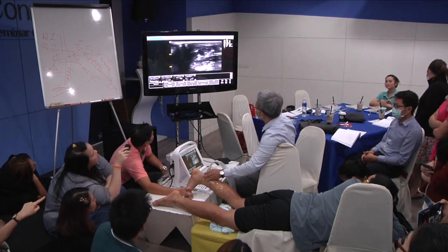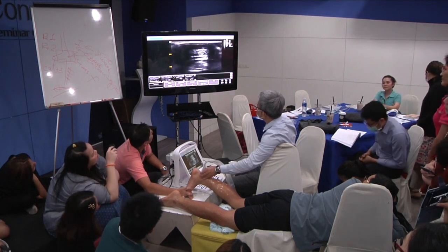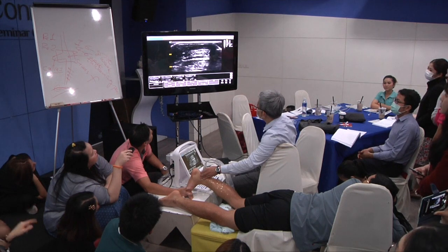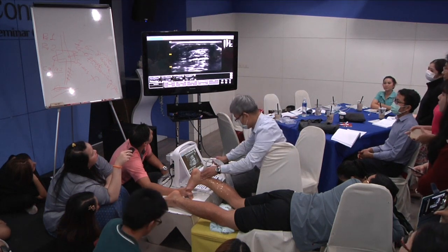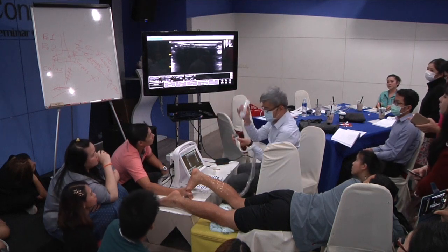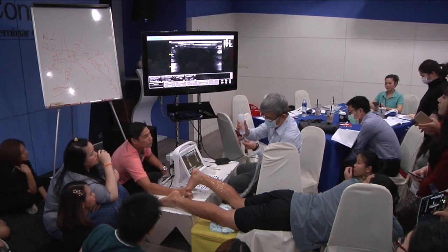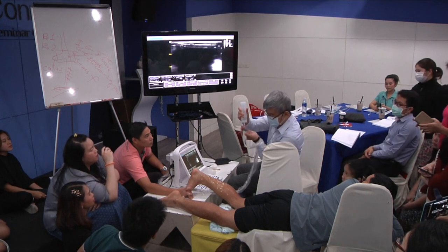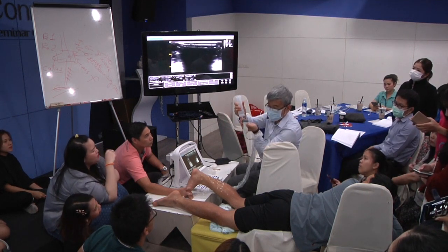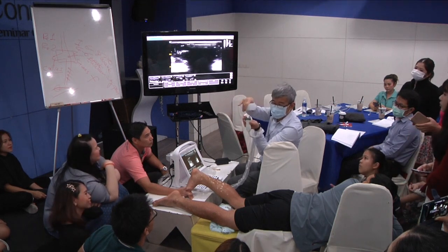Now we go to the end of the Achilles tendon. That will be easier. Yeah, very bright. Okay, so another skill that never existed before. You put the gel in two ends, just two ends.